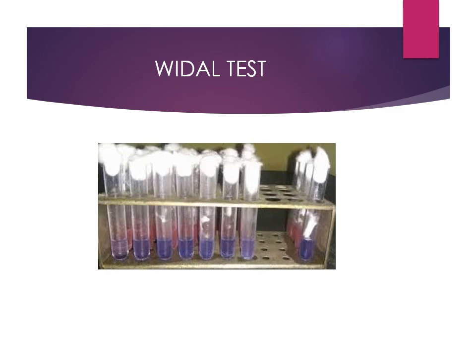Next day you will see whether the antigen-antibody reaction has taken place, so that you can notice the agglutination. In the O tube you will notice chalk-like clumps. If there is no reaction, you will notice a blue button. Similarly in the pink one, you will notice some cotton-like agglutination. You will measure up to which tube, or up to which titer, the agglutination has been noticed. On that basis we give the reading of the agglutination in the O and the H.